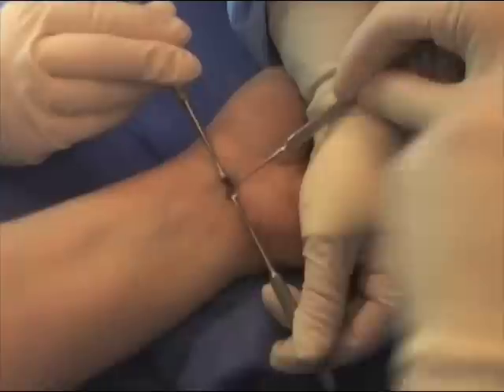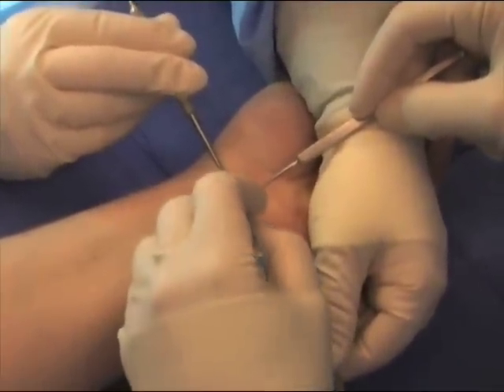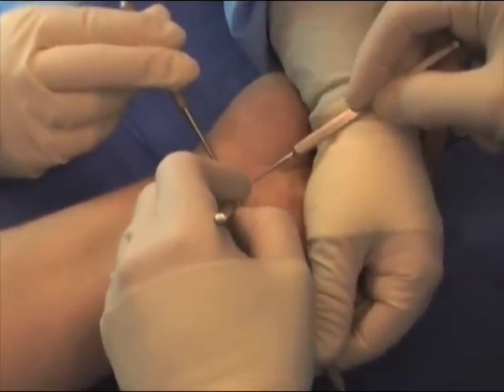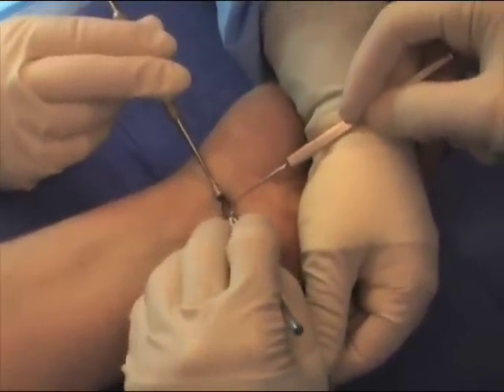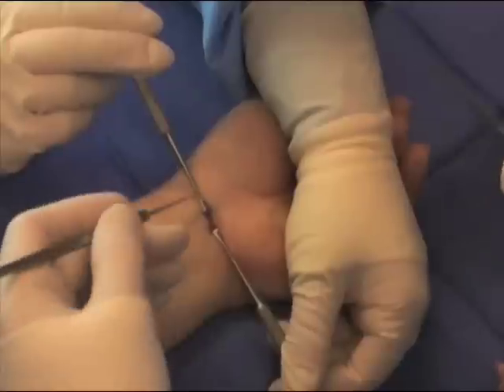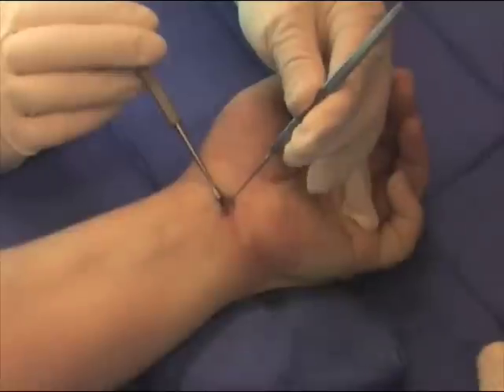Specialized retractors are used to provide access to the palmar fascia and distal forearm fascia. A small window is made to allow access to the carpal canal. The distal forearm fascia is then released.